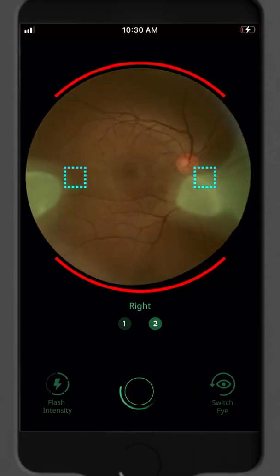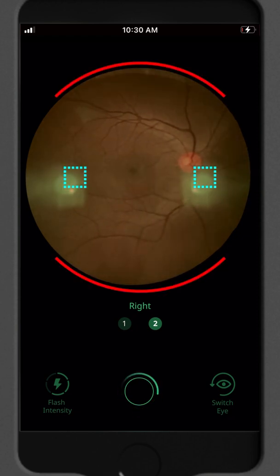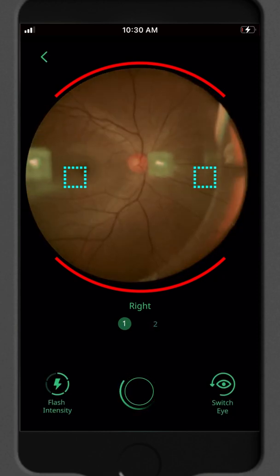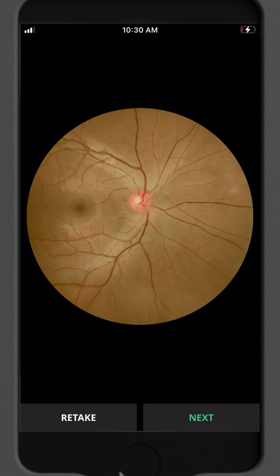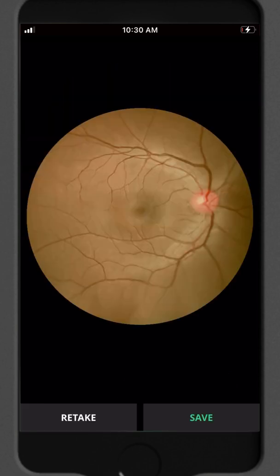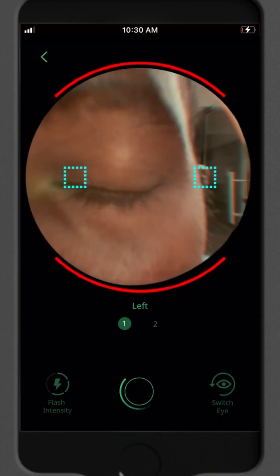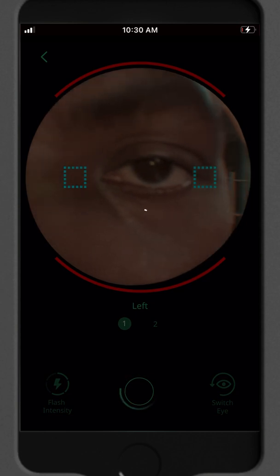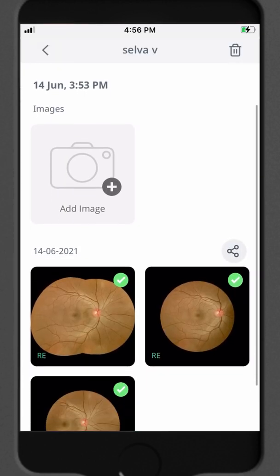Once the retina is in view, you will see two squares of light. Align these two light squares with the green squares that you see on the screen. Once all the squares are aligned, an image will be captured automatically. If you think the image is okay, click on next to proceed with the second image of the same eye. Now Vistaro is ready to capture the left eye — move the device and repeat the same process. You can view all the images you've taken in the patient folder. Each eye will have two images and a third montaged image.